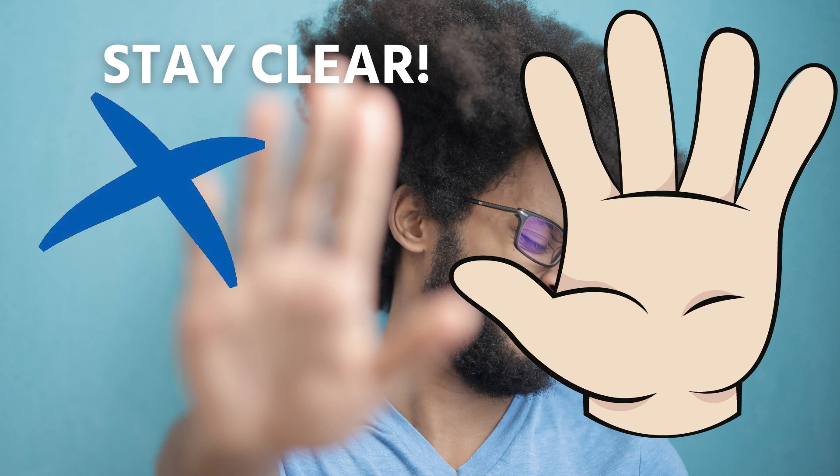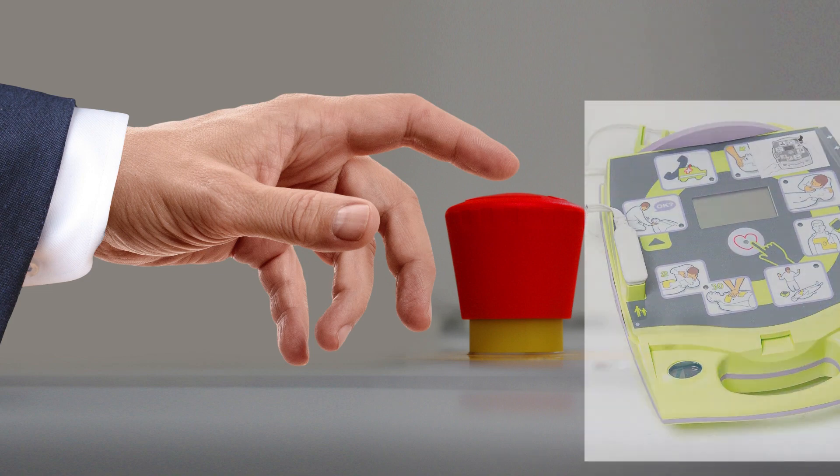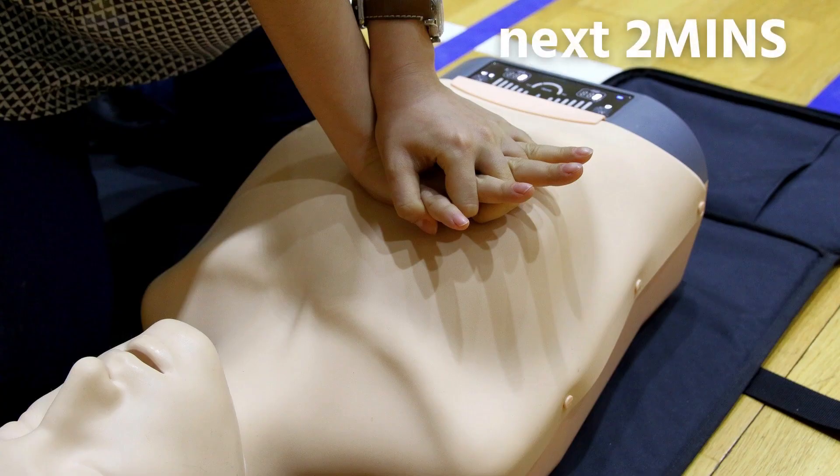Once the pads are attached, tell everyone — including yourself — to avoid touching the patient so as to avoid false readings by the unit. Don't worry if you forget; the AED will remind you.